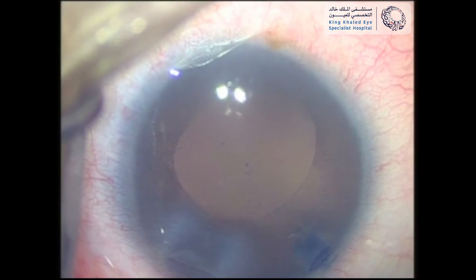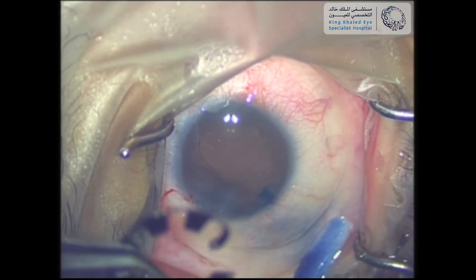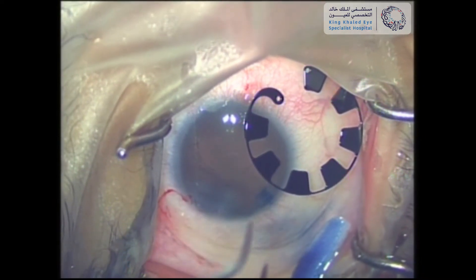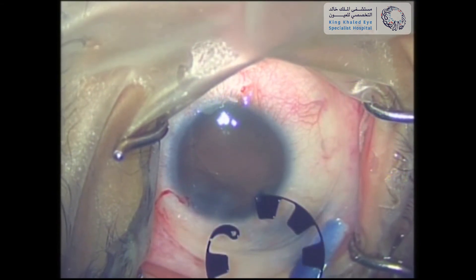Now that the cataract was removed, the next step was inserting the aniridia rings. The ring can be handled easily — it is inserted without an injector and manipulated intraocularly without any difficulty. However, the rings are fragile and care must be taken to avoid breaking them, especially during insertion.